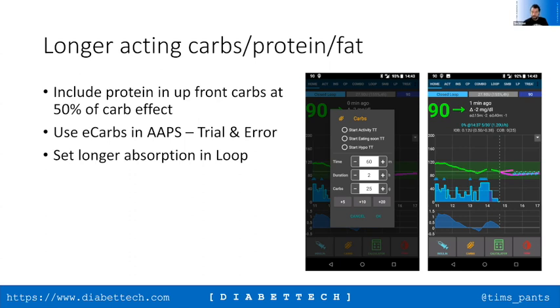Does anybody want to comment on any of this stuff? Because I know there were questions about how to deal with this type of thing at meal times. You mentioned earlier that you were taking 60% of the bolus insulin and letting APS work out the rest, if I understood correctly. How do you set that one up? Because in the bolus calculator, you just enter the full amount of carb that you're taking, and there isn't an instruction to say apply 60% or whatever percent you want to.